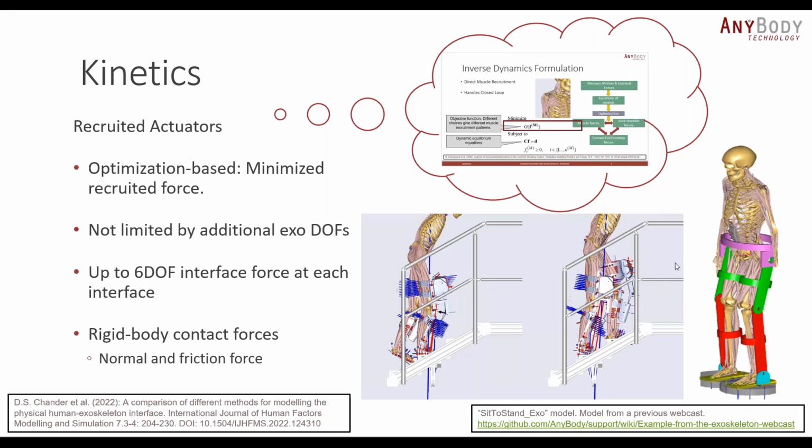Alternatively, you could also set up these recruited actuators to simulate rigid body contact force, so considering normal and friction force. This is how we set up the model that I worked on during my PhD, a model for a stair assist exoskeleton.